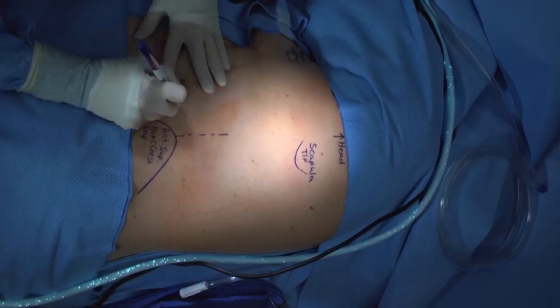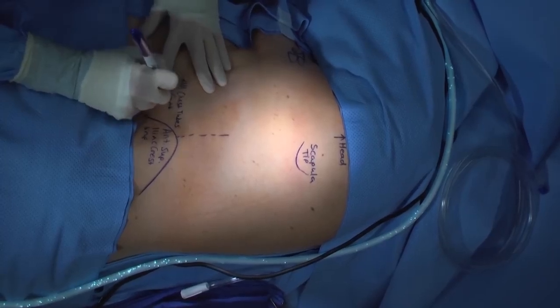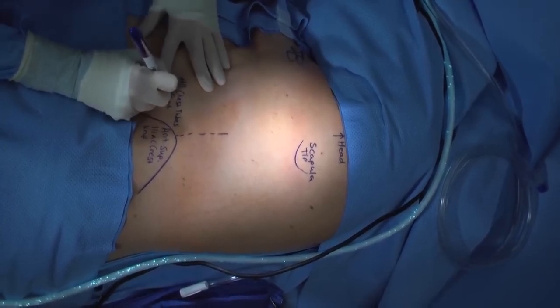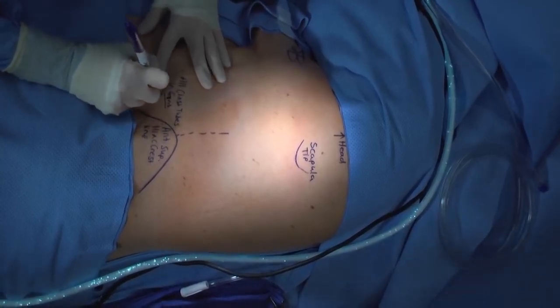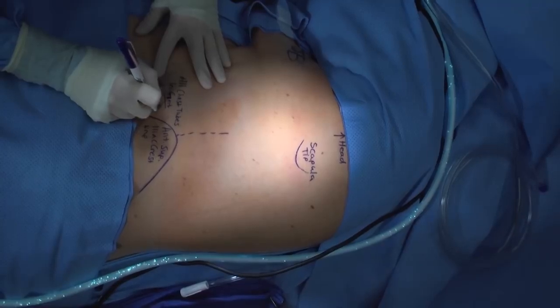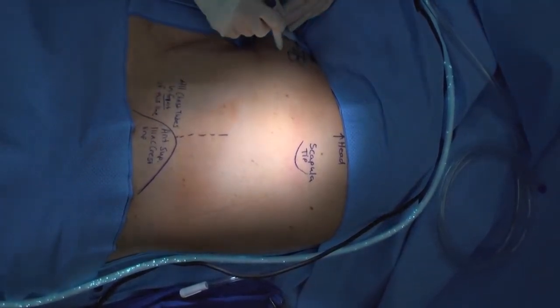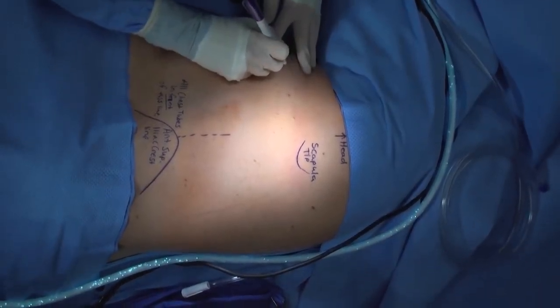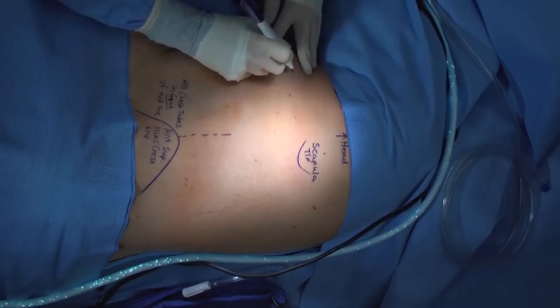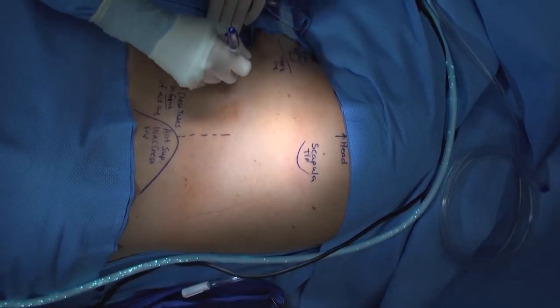It is ideal to place chest tubes in front of this line for patient comfort so that they're not laying on the chest tube. There are, of course, some special circumstances in which an alternate location will be required, in particular if you're aiming for a loculation, and sometimes you are limited by casting or hardware. Next, identify the nipple and the inframammary or pectoral crease. This is the line in which you're going to be placing your chest tube.